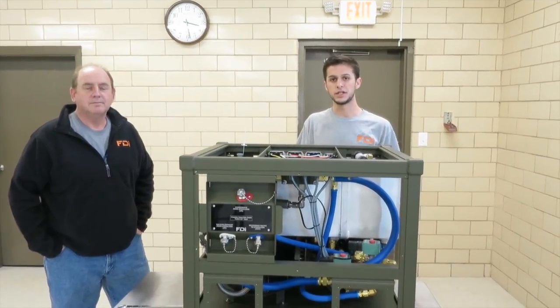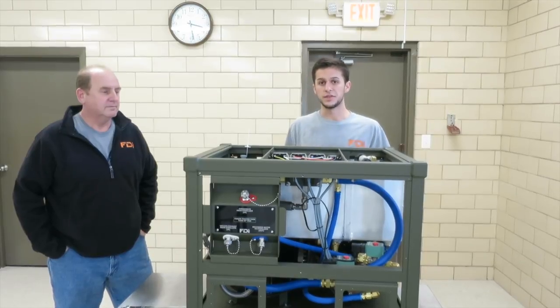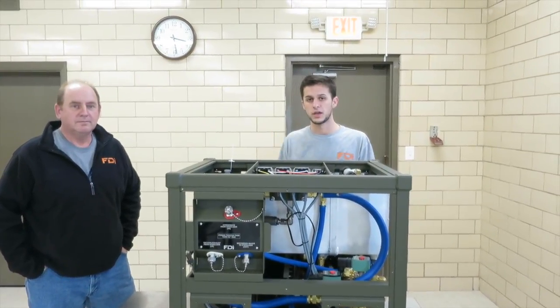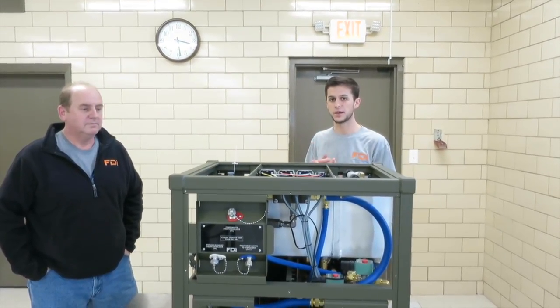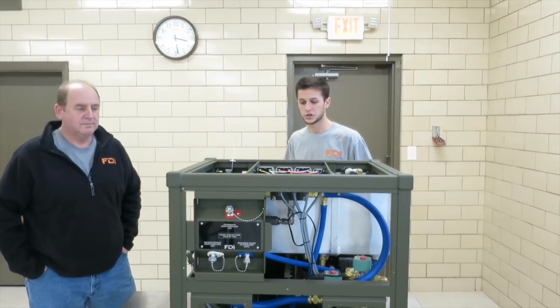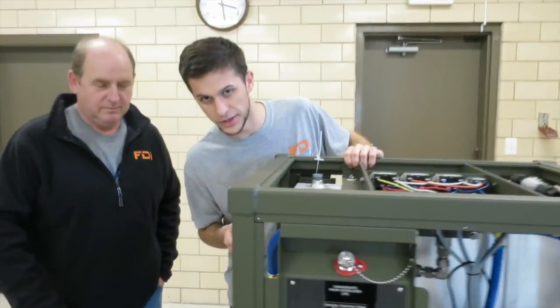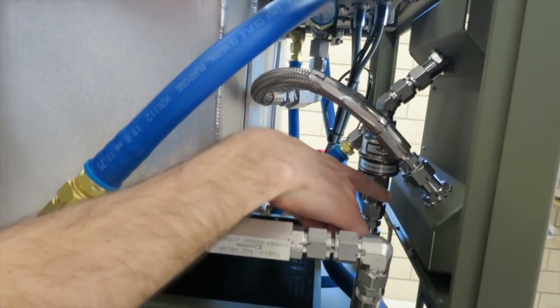We're talking about the P2131 Automated Field Steam Sterilizer. In this maintenance video, we're going to talk about how to replace the steam trap, so you can follow along in the manual. Pretty simple, a few steps, and Steve's going to show us how to do it. So if you come in here and zoom in, we've got the steam trap right here.